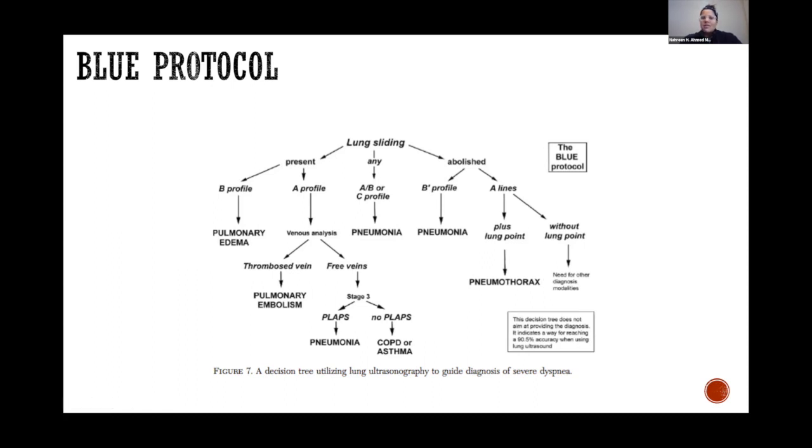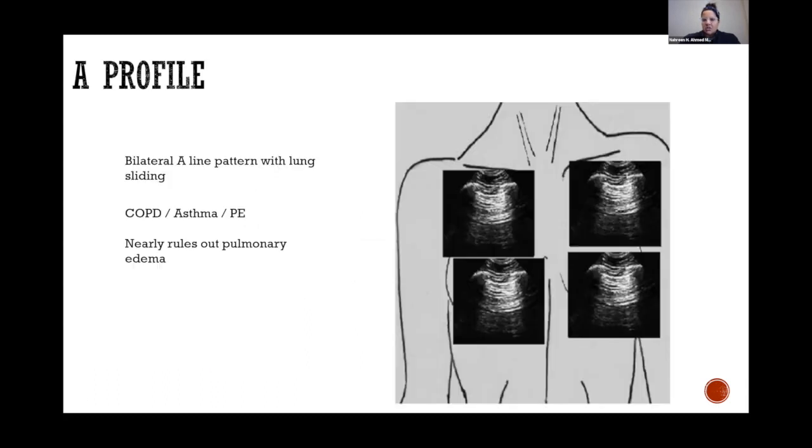Okay, so again, this is a very simplified version of how to utilize what I'm teaching you and what I'm showing you. Remember, there are so many other things that can fall outside of this tree, but it's really just to give you a helpful place to start.